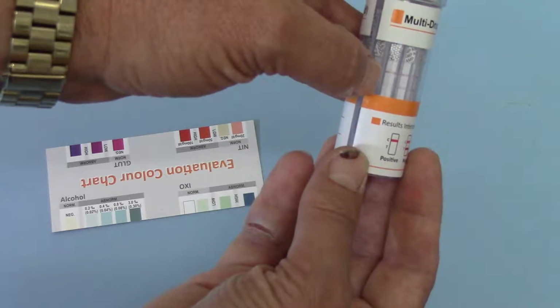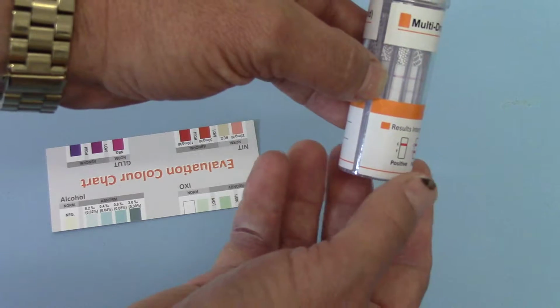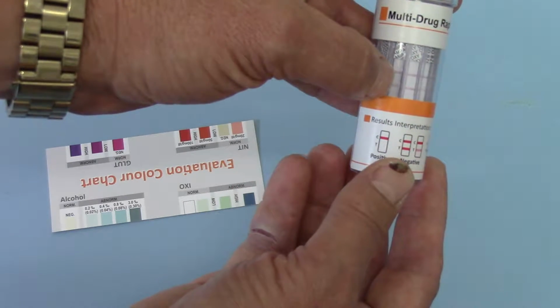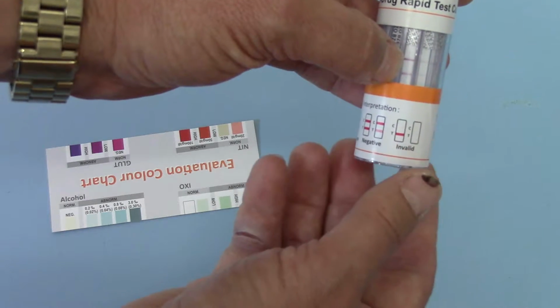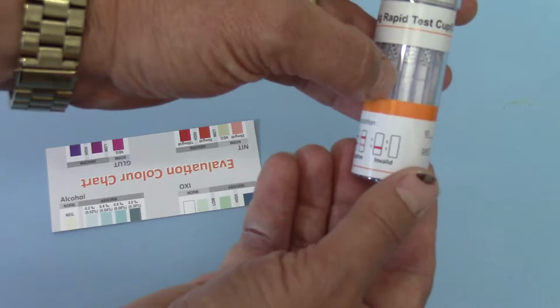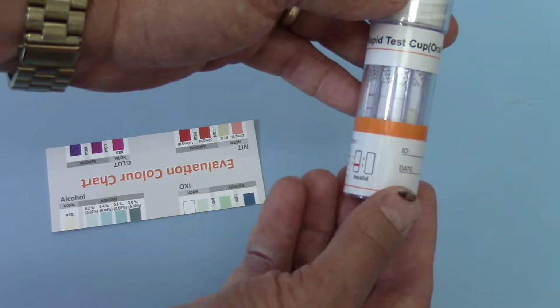same for OPI. The cocaine membrane, you'll see, the test result is thin and faint, but it's still there, it's a negative result, same for amphetamine, oxycodone, benzodiazepines, methadone, cannabis. PCP has a very faint test line there, but again a discernible line.